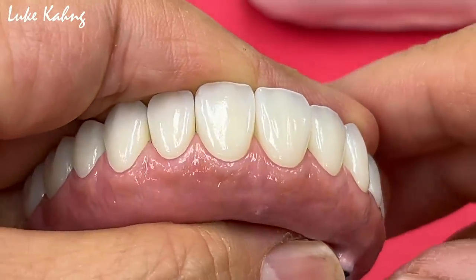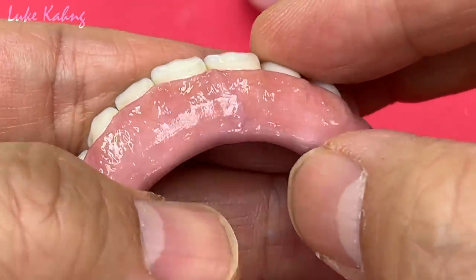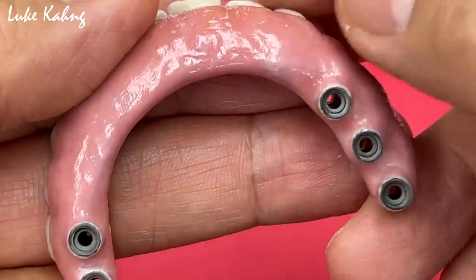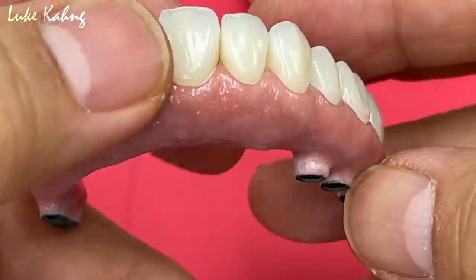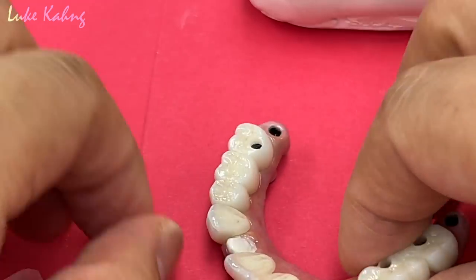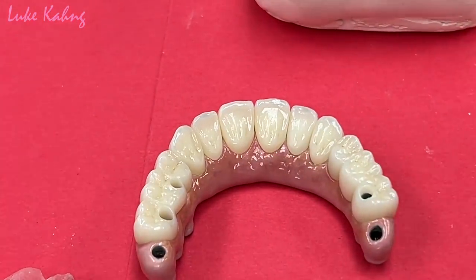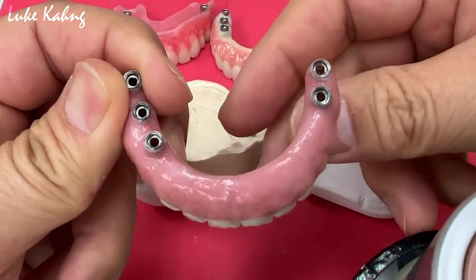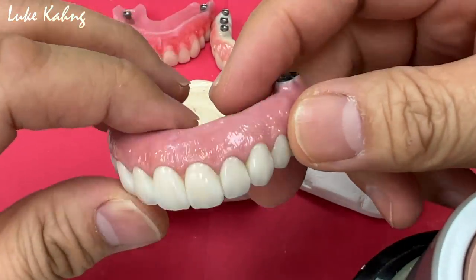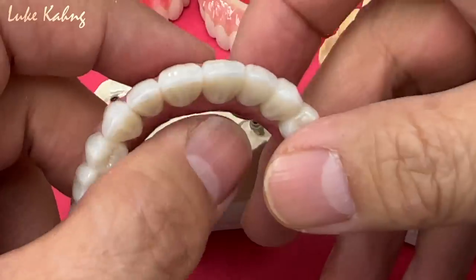This is what Syton 7 Star looks like, the top of the line, the tissue contours, the whole convexity is a very strong hybrid bar, no welding, just machine milled. So it was a long journey, but we finished it, 98% is done. Now is after cement. You saw my old cementation, so I don't have to show you how I cement it. Please take a look at it.